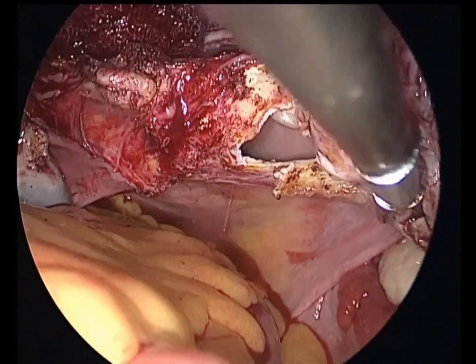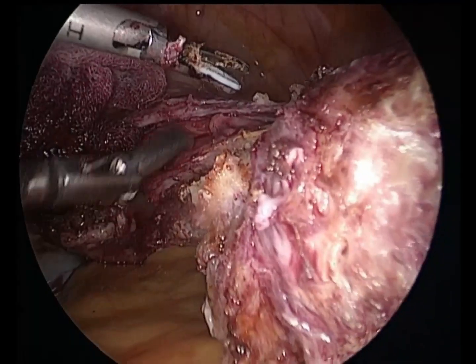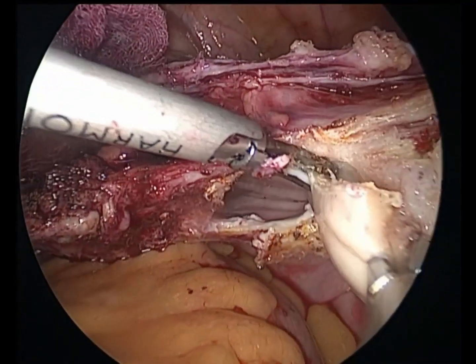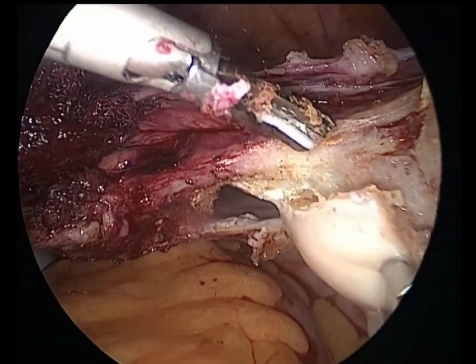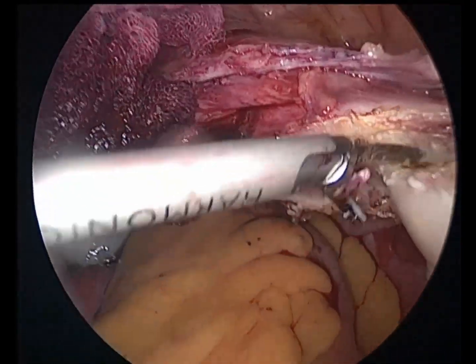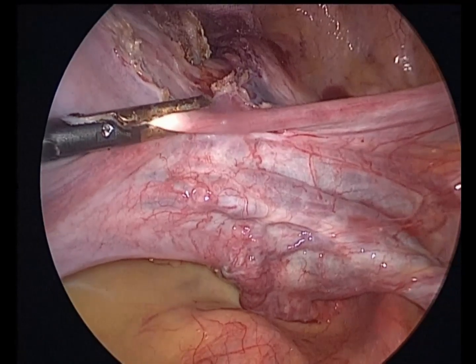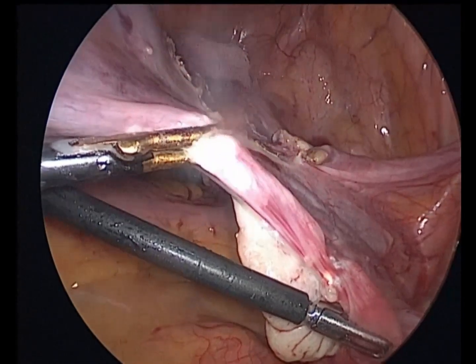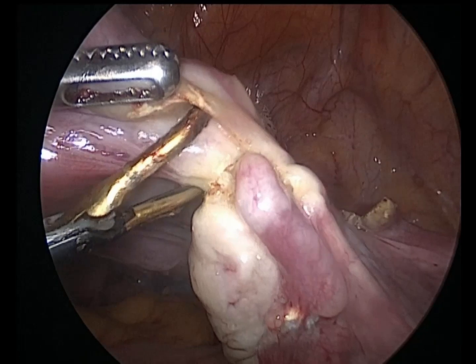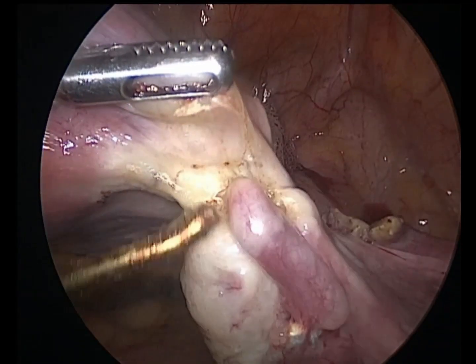We have to learn to use the harmonic in the left hand. Most of the dissection of the right side we have done from the left side. Now we are cutting the right broad ligament, separating the rest of the urinary bladder.